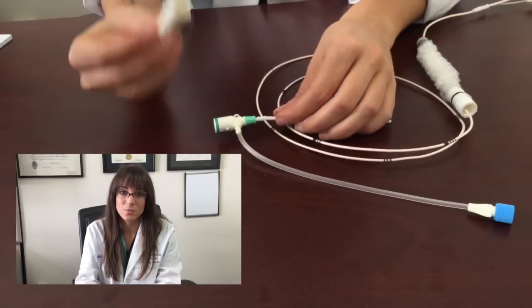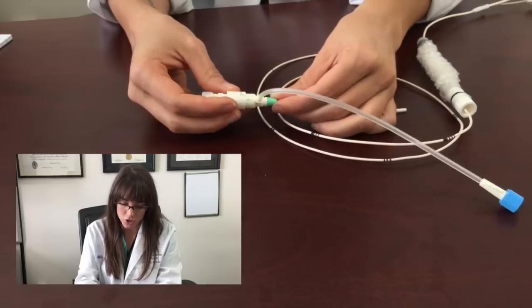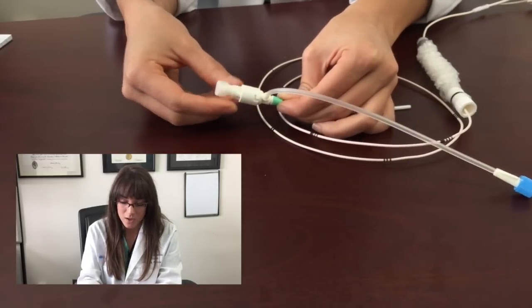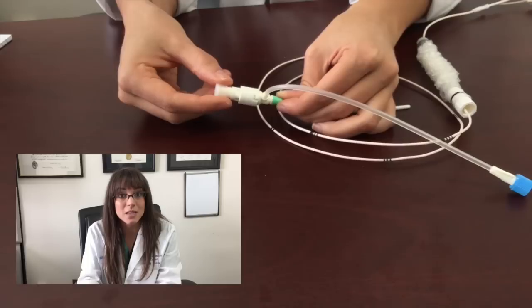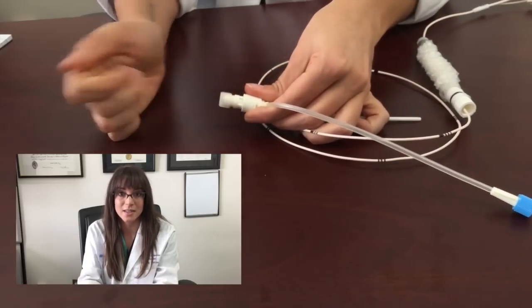The next step is very simple but really important. What we are going to do is take this adapter and place it onto the introducer sheath. Place it like this and now it is locked in. The reason this is important is that once the pacemaker is in the correct place, this will tie it down and it won't move.